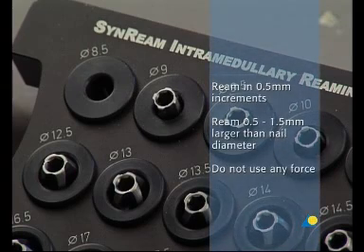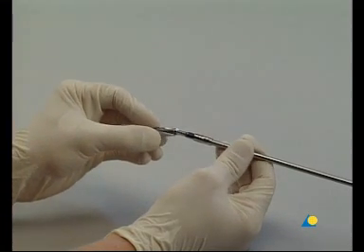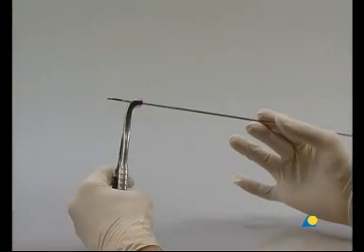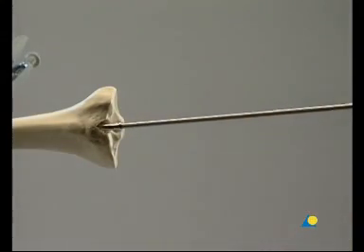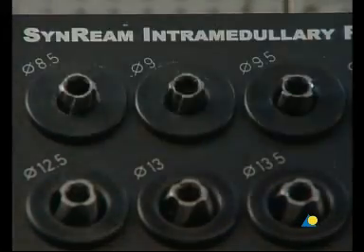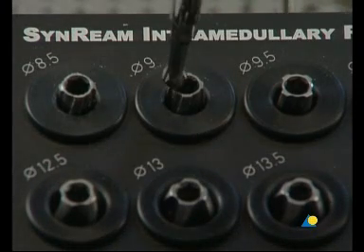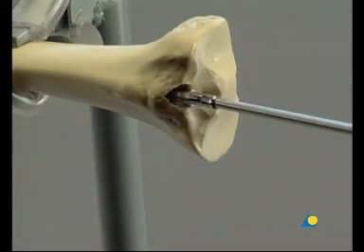Depending on the diameter of the nail, the appropriate diameter reamer heads are selected. In this case, the nail diameter is 9 millimeters, so reamer heads from 8.5 to 10 millimeters will be used. The reamer head is mounted on the flexible shaft. The holding forceps is used to control the position of the reaming rod. The reaming rod is inserted into the medullary canal. The reamer head is advanced with gentle back and forth movements. Force must not be used. The medullary canal is reamed in 0.5 millimeter increments until the diameter of the canal is 0.5 to 1.5 millimeters larger than the nail diameter.